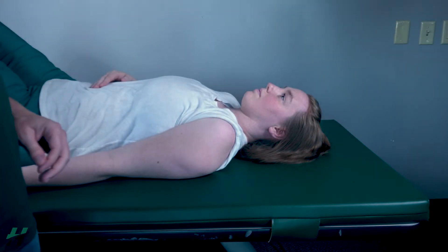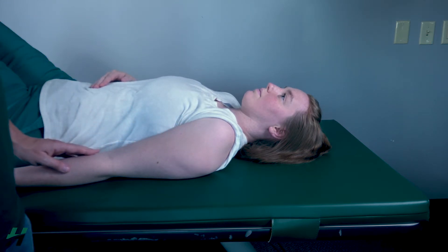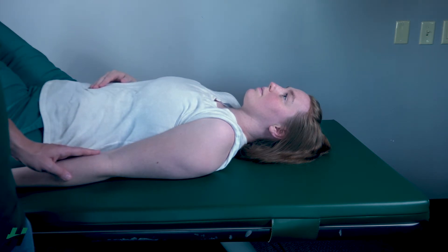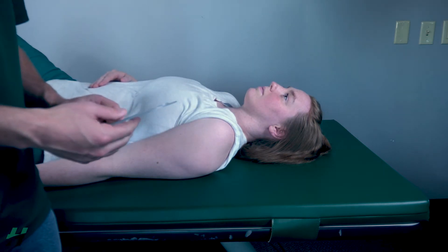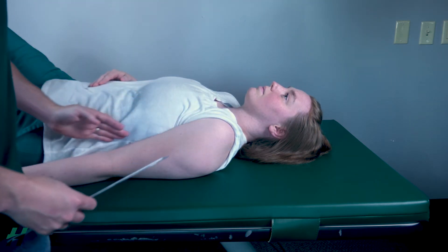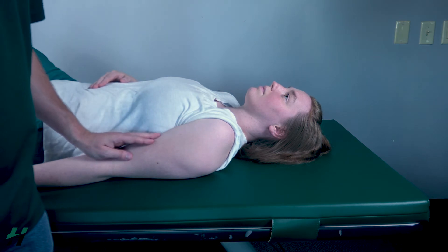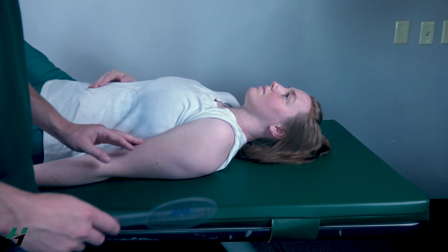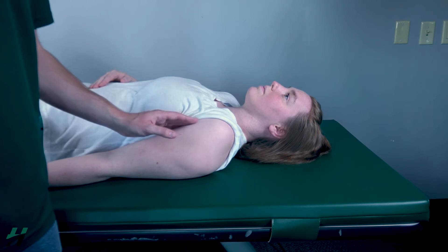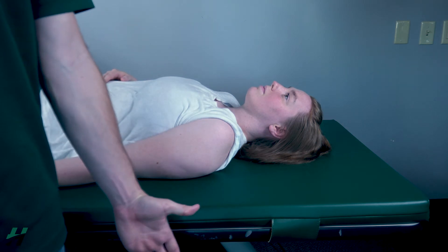Measuring shoulder abduction, the patient will be in a seated or supine position. Keep in mind that in the supine position gravity is eliminated, while in a seated position they will be working against gravity, so be consistent with whatever way you do it. You want the axis of your goniometer on the humeral head, the stationary arm running parallel with the body, and the movement arm running along the shaft of the humerus. When your patient performs abduction, make sure their thumb leads the way and their palm is towards the ceiling.